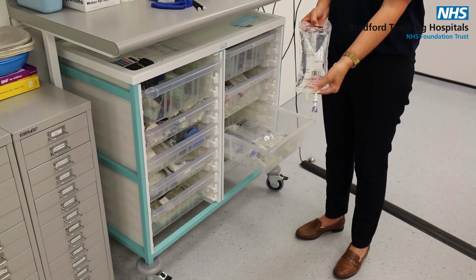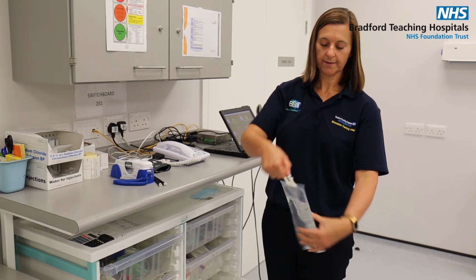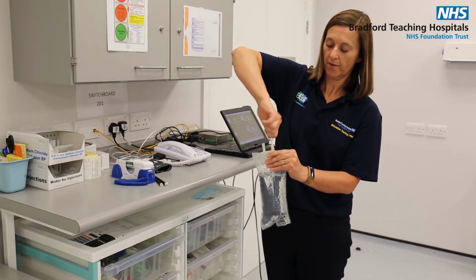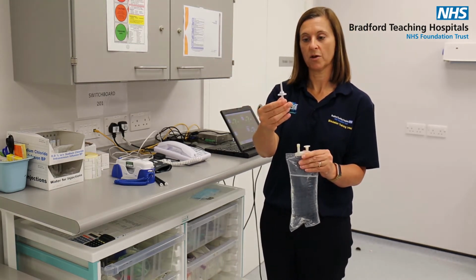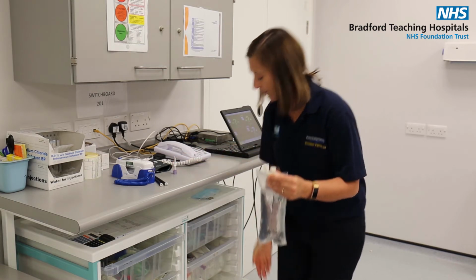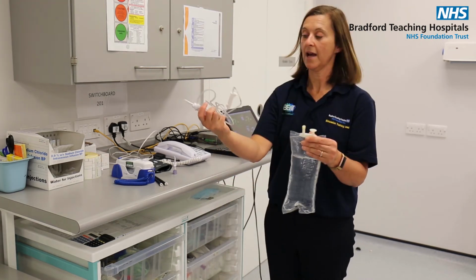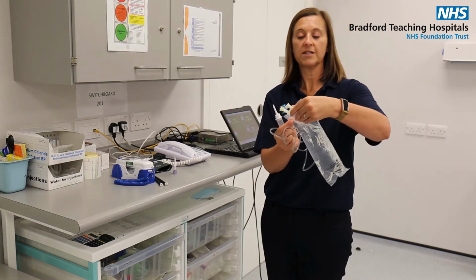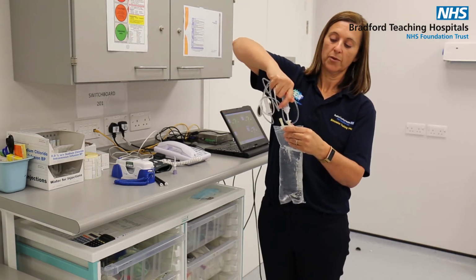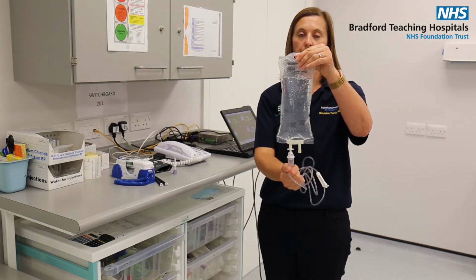We reuse all IV fluids. If you want to use IV fluids, then if you remove the bung out of the top of the fluid bag, please do not throw that away, as we just refill these with tap water and use them. However, put a giving set in, again out of packaging. Please do not tip the bag up, otherwise you will end up with wet feet. Put the giving set in that way around and then invert the bag.